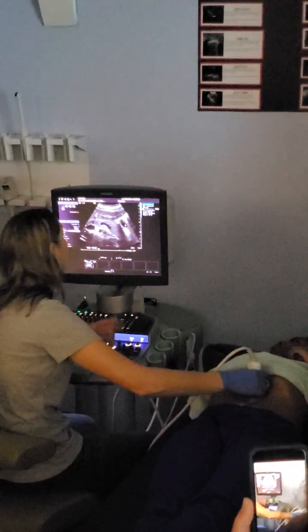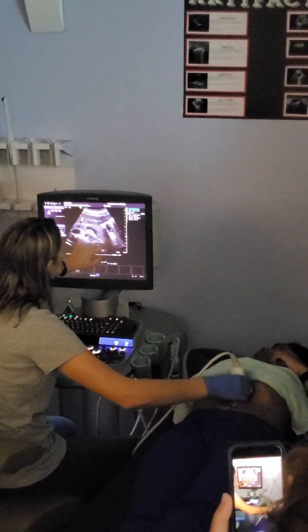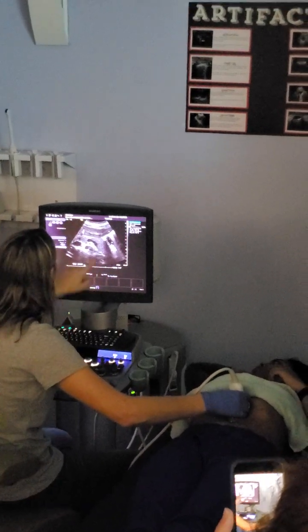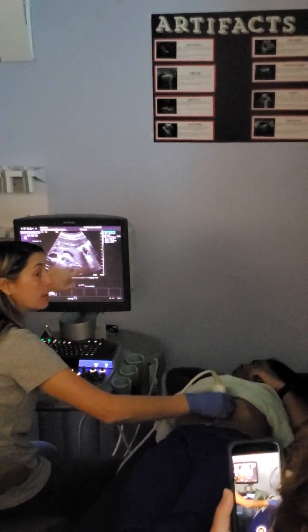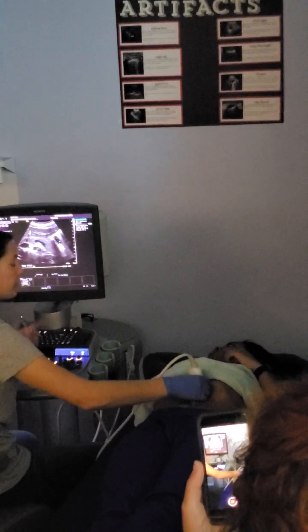So we're going to have 2 transverse pegs. One that's really going to delineate the uncinate head, neck, body, and one that's going to be body and tail. How about that dark spot right there that you just pointed at? That's just edge artifact off the stomach. We can still see the pigtail. We see that we've cleared the border of it. It's just edge artifact off the stomach, which physics happens, right?